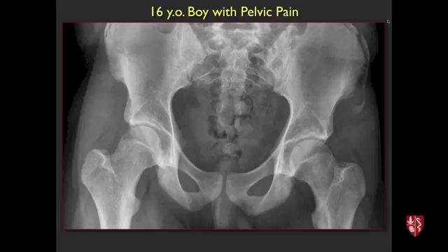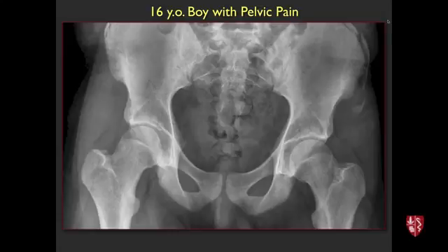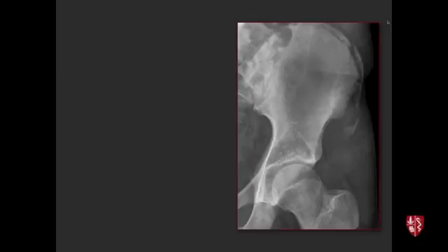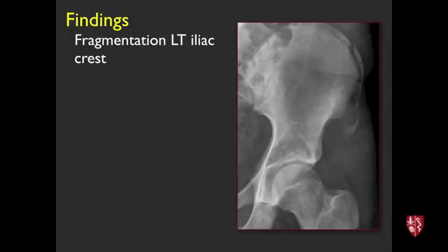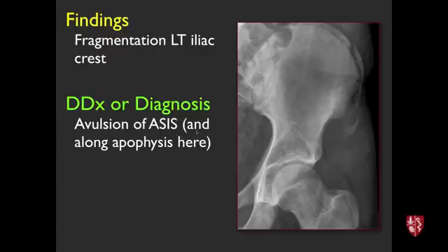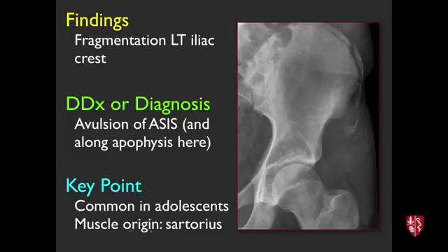Here's the first real case. What we're seeing is fragmentation along the iliac crest in this skeletally immature patient — this part is avulsed off. This is avulsion of the anterior superior iliac spine; he's avulsed off a little bit of his apophysis. Key point: fairly common in adolescence, and the muscle origin there is the sartorius.